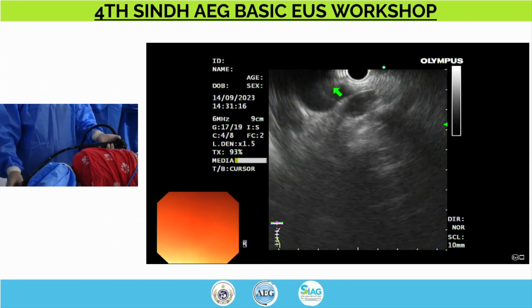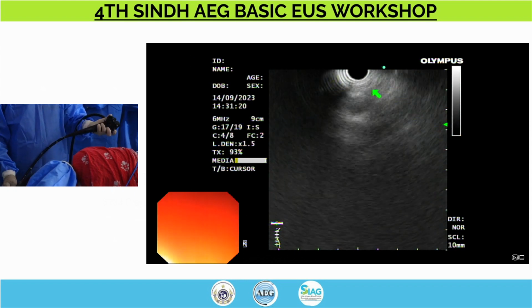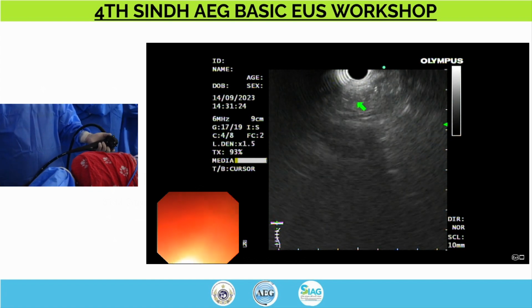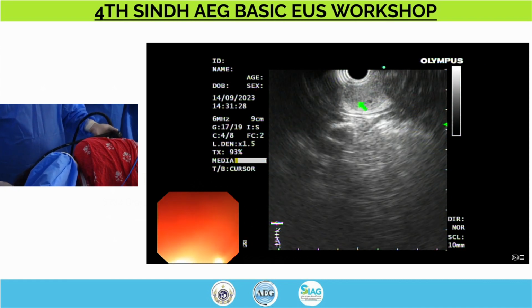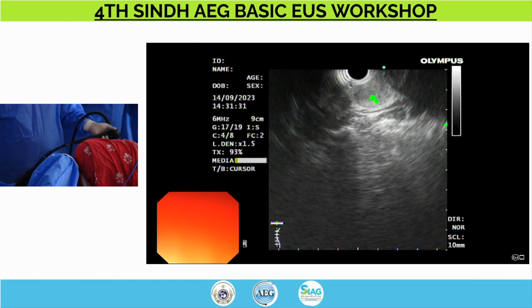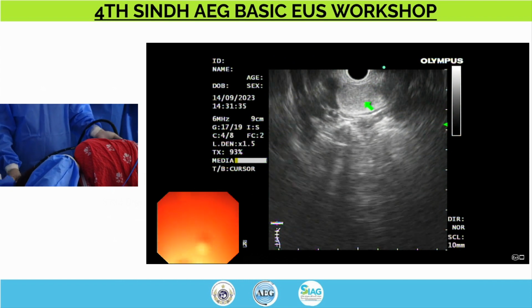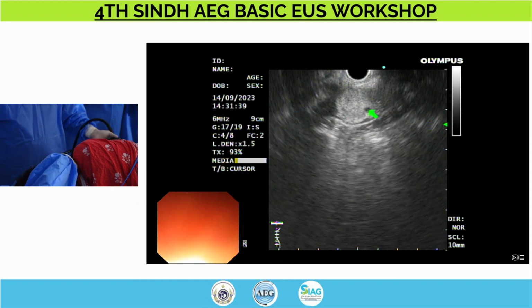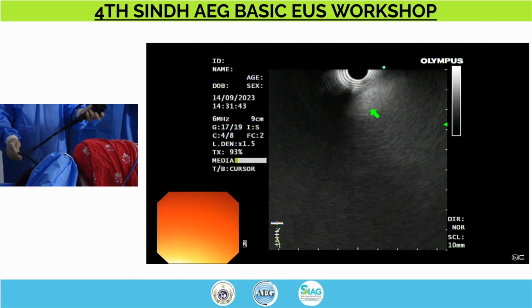If you are interested in doing a further exam, you can pull it up. You can get to the left carotid and subclavian, and you see this thyroid gland, which sometimes looks really like pancreas tissue, but we're right at the neck, right at the oropharyngeal area, and she may have something in the thyroid, a small cyst right there. Okay. And we are out.